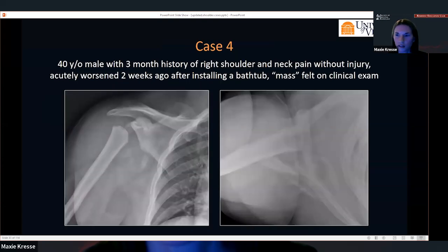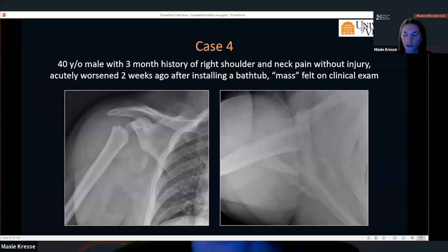All right. So moving on to case number 4.